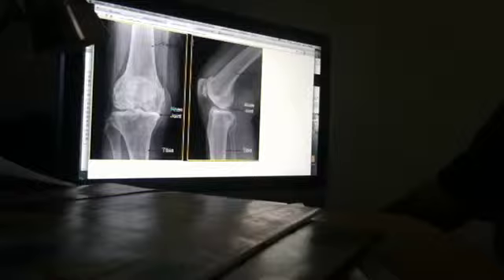For lateral, you want to have the superimposition of the condyles, and that you're just seeing the lateral border of the patella, and have a little bit of superimposition of the head of the fibula on the backside of the tibia.